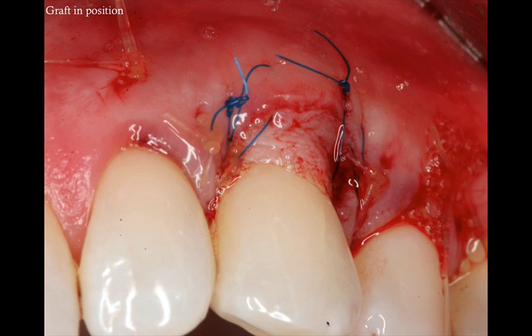Now, I was not 100% successful with that because the tissue was very thin, very friable, and I was concerned with perforation. So I didn't want to apply too much coronal pressure, and I counted on the fact that the majority of the graft is well secured and under vascularized tissue.